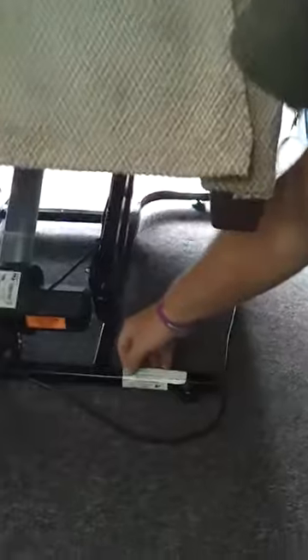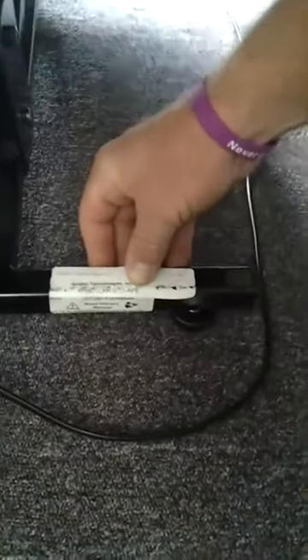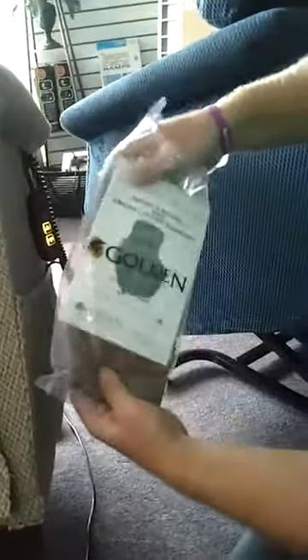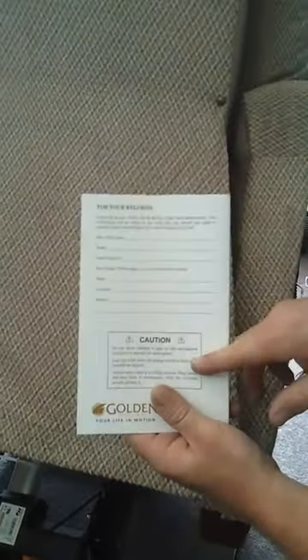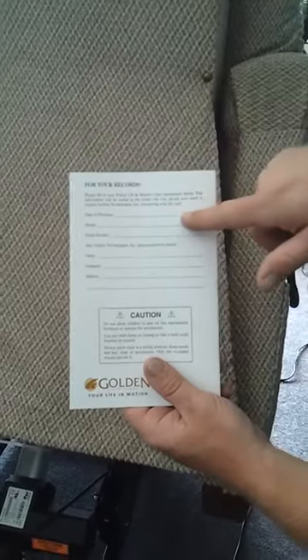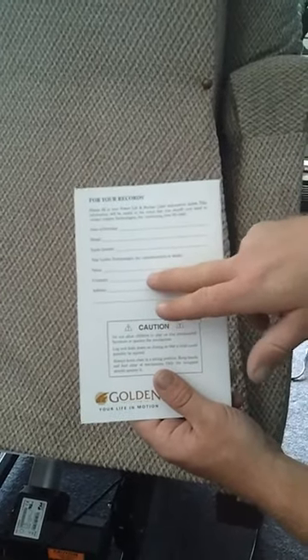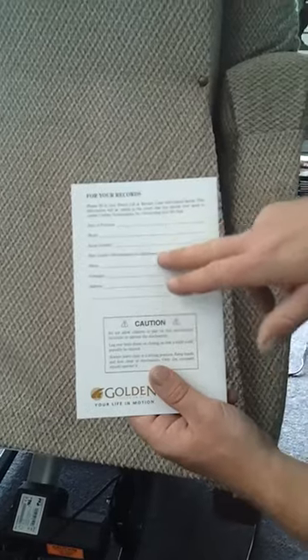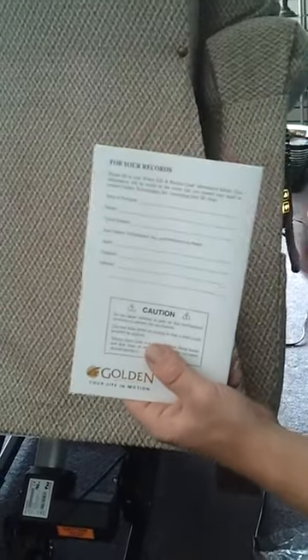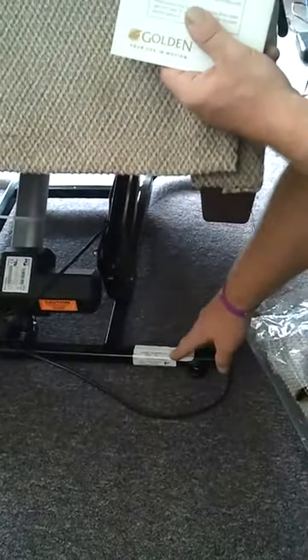Your serial numbers are back here on most chairs. With Golden Technologies, they give you a booklet, and you want to keep this in the chair at all times so you can write the date of purchase, your model, serial number, the name of the company, address, and so on. That way all your information is always with the chair, regardless if the labels tend to fade over time.